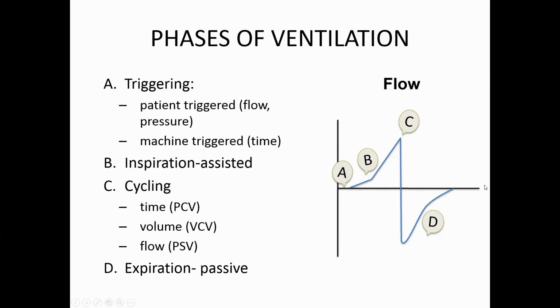Cycling can either be time related, saying okay, stop giving breath at a certain time, or it can be giving a certain volume, or a certain pressure support flow basically. So for the cycling, those are inherent to those various modes. So can you have a flow cycle breath on a pressure control? No, it depends on how you decide. Okay.